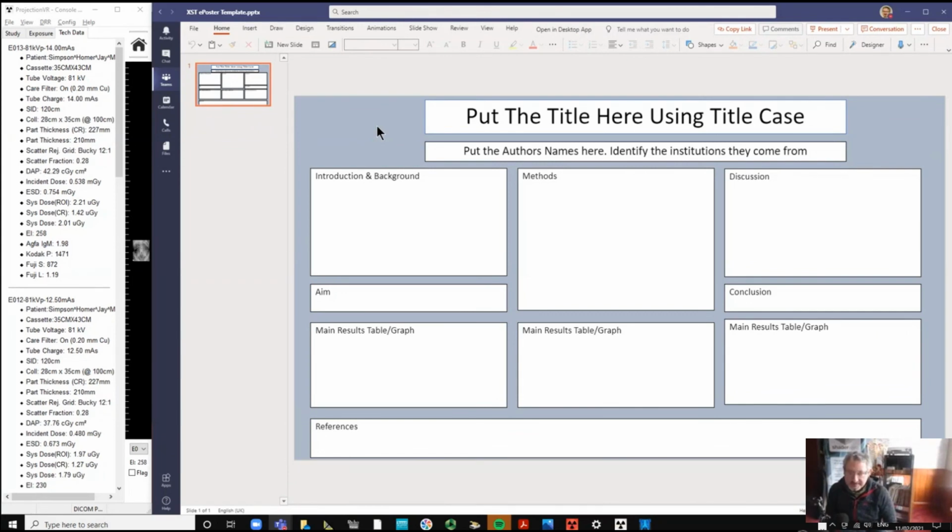And also, when you read the paper, was it confusing? It just waffled on. Basically, the experiment's far simpler than they make it seem. We've given this a few hours of our time, haven't we? We did an hour last week where we looked at the paper, deconstructed the experiment and came up with the spreadsheet.